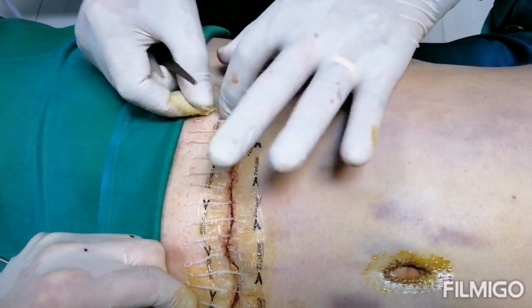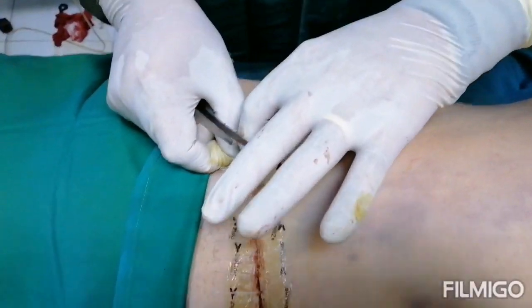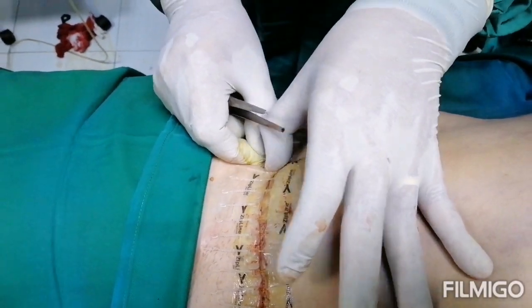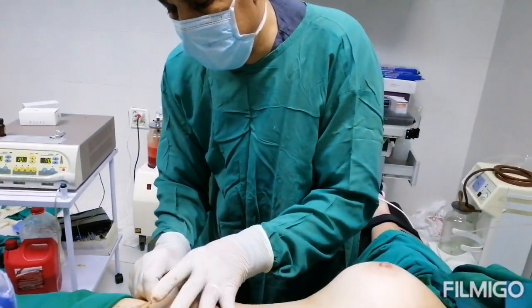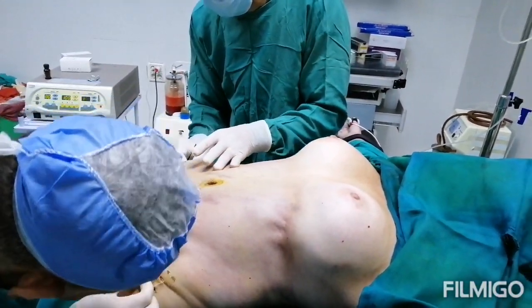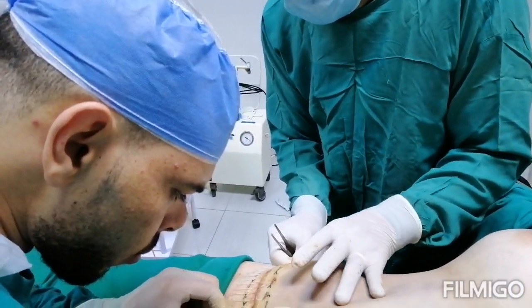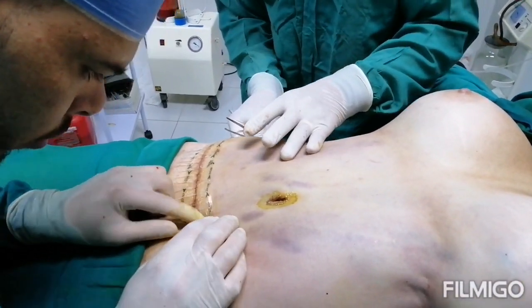The advantage of the zip line: no sutures, no scars, nothing visible after the surgery. It stays on for two weeks, then you can remove it after that. The patient can remove it themselves because it is just like a sticky tape.